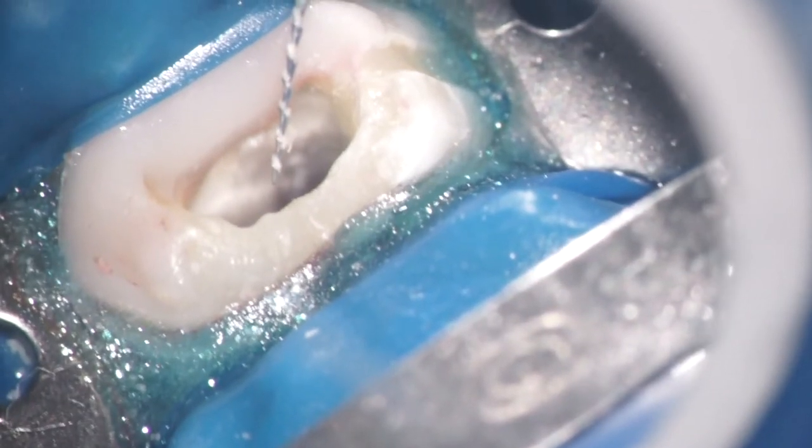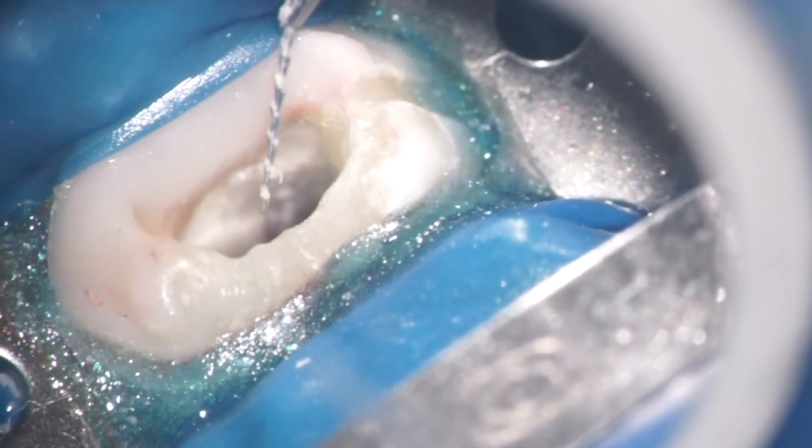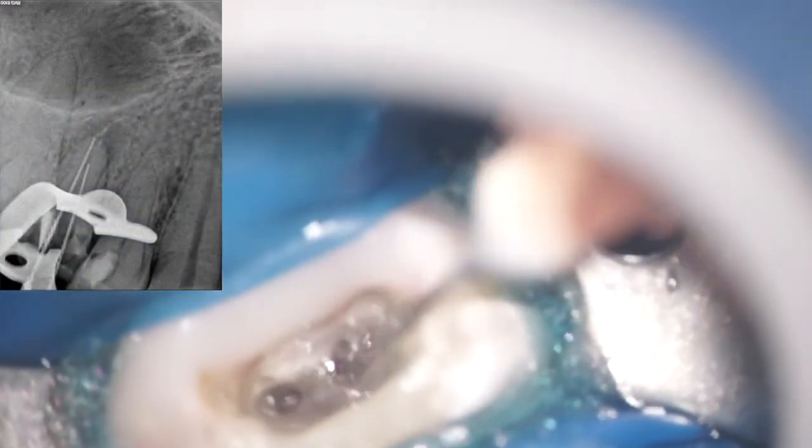You can see I'm trying to place the BTR loop right now over the entire head of the instrument, which is now very clearly visible. We use this as a lasso over the separated instrument, which has been loosened with ultrasonics but is not popping out easily. So we grab the head, tighten it with the BTR loop, and once we pull it out, you can see the entire instrument along its full length is completely out.